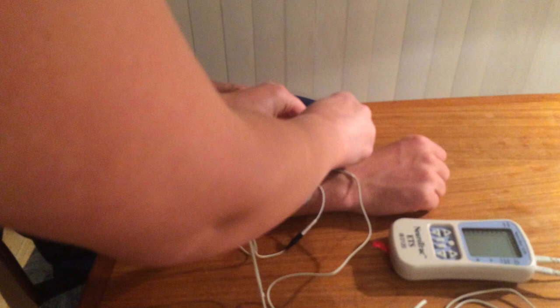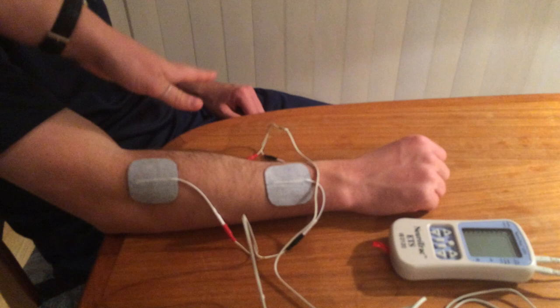For this one I've got channel A on the wrist extensors and channel B on the wrist flexors, but it doesn't matter either way — they're both going to get a workout.